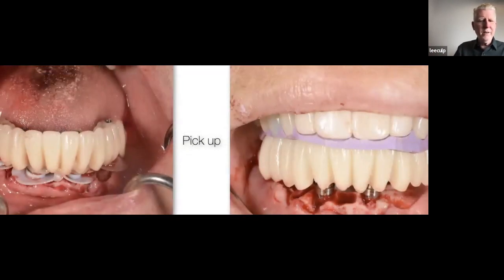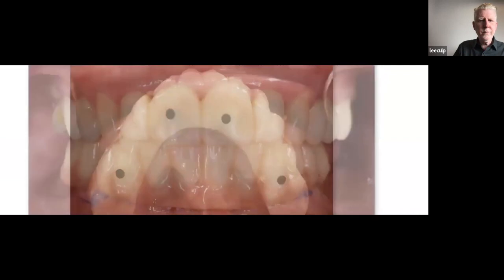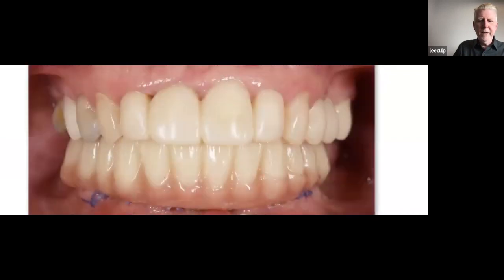So now attaching, we've got a bite to make sure it's in the proper area. We're resting on 3 bone areas. We've got a bite to make sure it's lined up correct. And then we're going to attach the converted denture to the implants. And you can see they come out pretty much right in the middle of the holes that were pre-created. They've got a very even layer of composite around to attach. And then I added some composite real quick and we finished that case up.